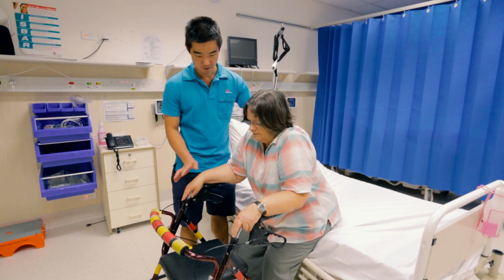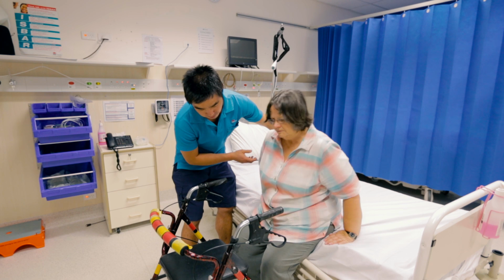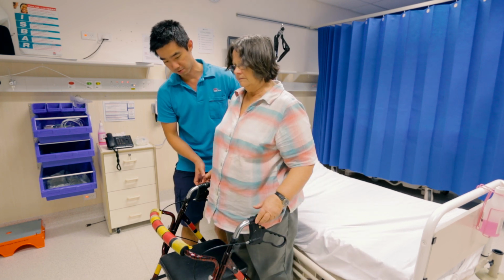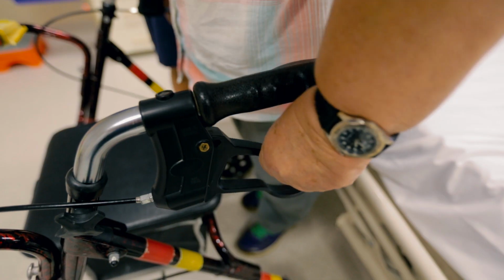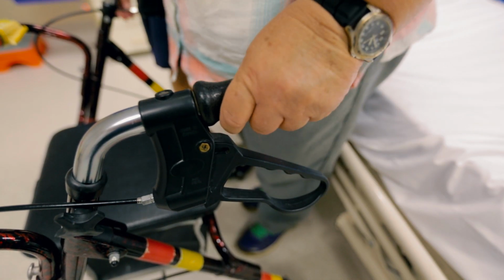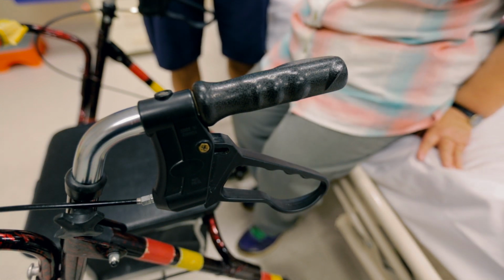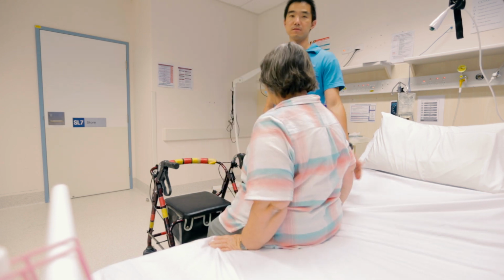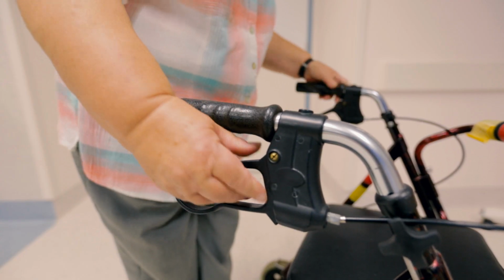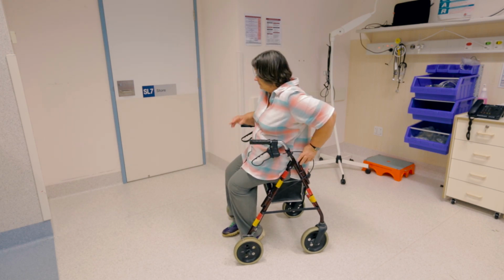Do not pull on the handles of the walker to stand up, as it may overbalance. A much safer method is to push down on the bed or chair to stand upright. It is also important not to sit in a chair or on a bed whilst still holding on to the 4-wheeled walker. Always feel for the arms of the chair or the bed before sitting down. When sitting on the 4-wheeled walker, ensure the brakes have been applied first.